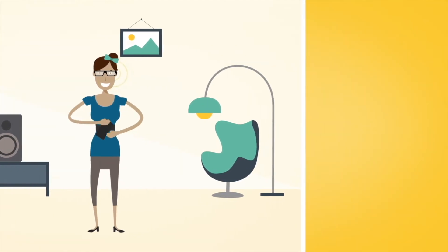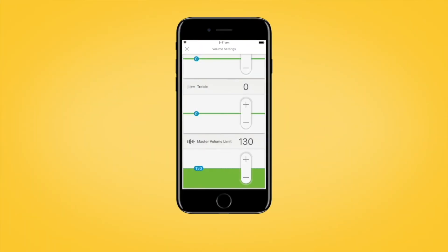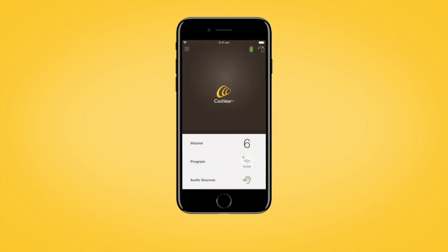To close volume settings, tap the X in the top left of the iPhone screen, or tap the back button on your compatible Android device.